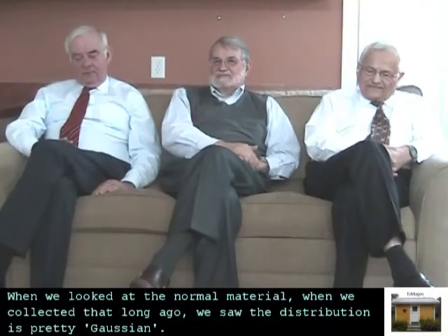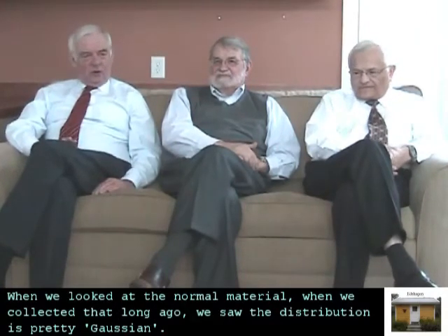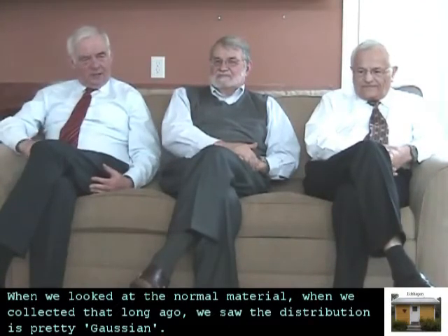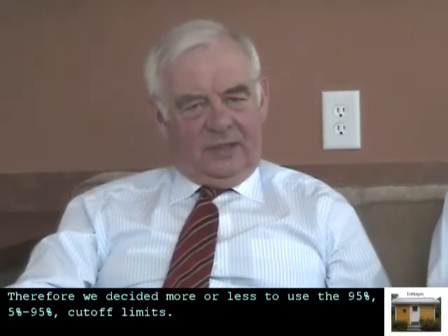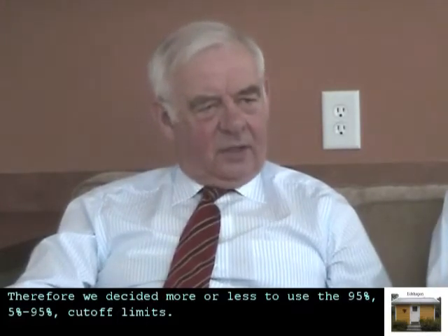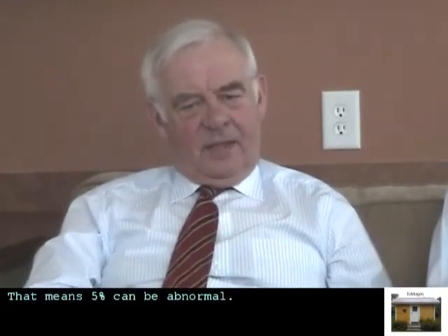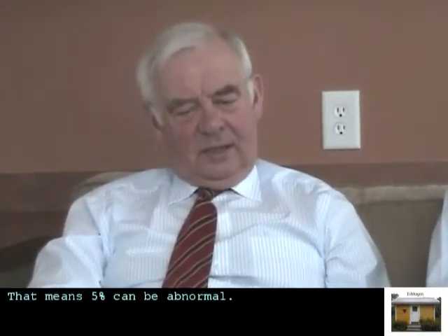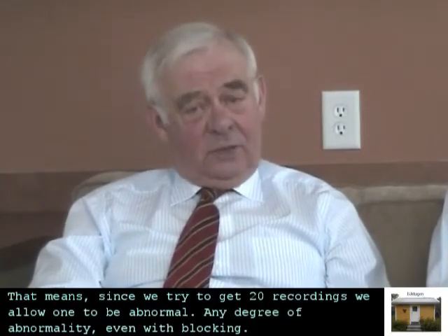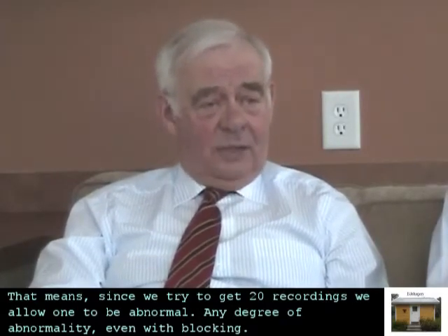When we looked at the normal material, when we collected that long ago, we saw that the distribution is pretty Gaussian, and therefore we decided more or less to use the 95% cut-off limits. That means that 5% can be abnormal. That means since we tried to get 20 recordings, we allow one to be abnormal.